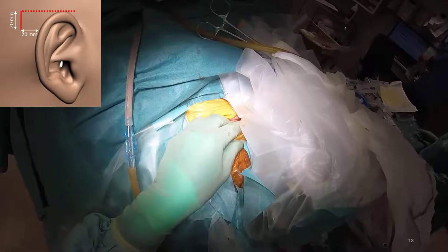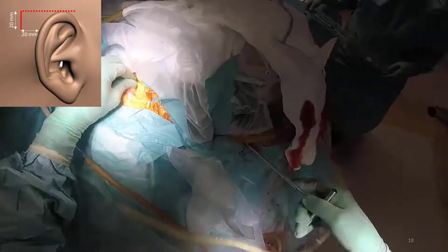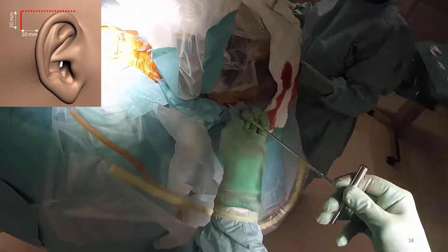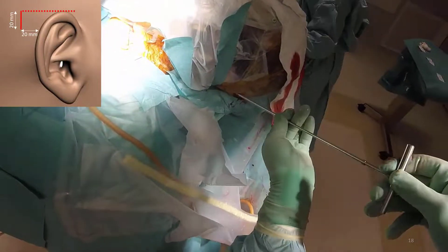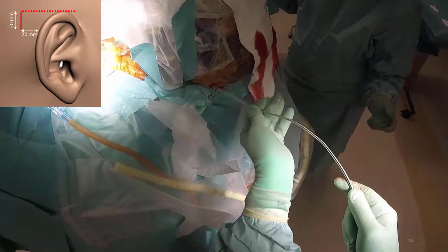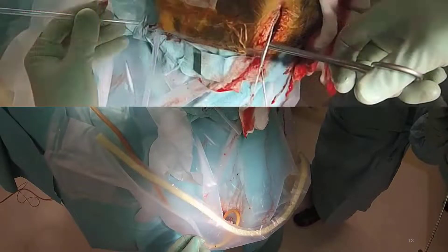I know that some colleagues believe that tunnelation of the extension cable with the frame in place might be difficult, but in reality it is actually rather simple as you see in this video. And often it is faster to use a big clamp for the tunnelation of the tube from the incision behind the ear to the skull incision, rather than using the tunnelation tool.